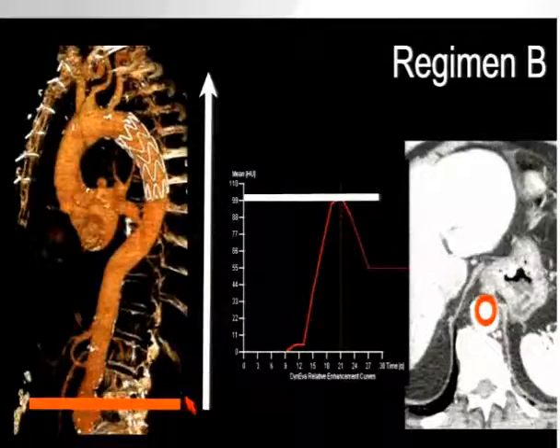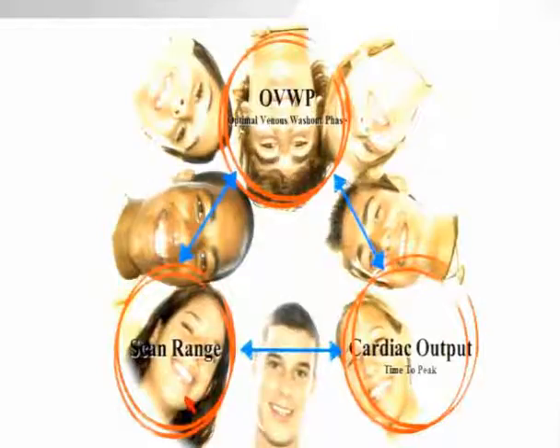So before we talk about this contrast formula, every patient that walks into your examination room or radiology room has different heights, weights, cardiovascular dynamics. It depends on their previous diseases, if someone has bradycardia or tachycardia. So all of these factors, it's really hard to predict when a patient is on your scanner table.